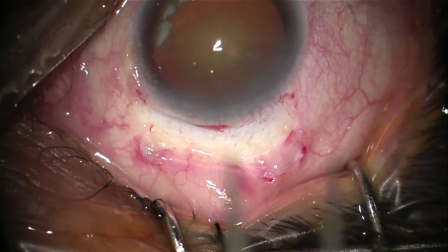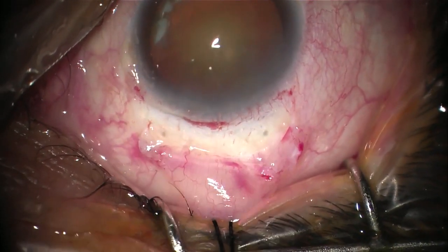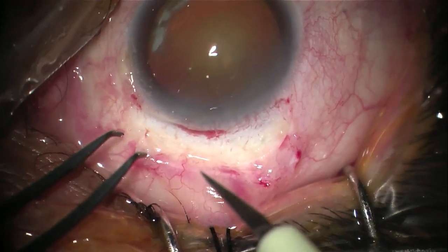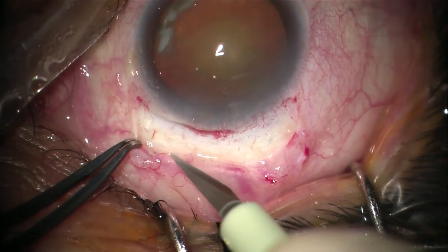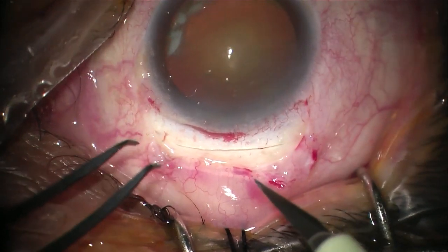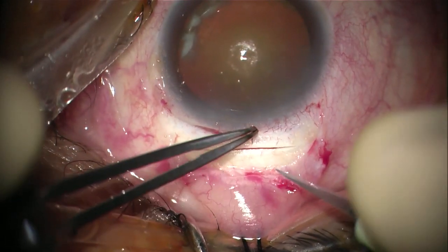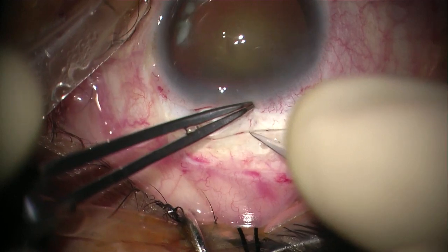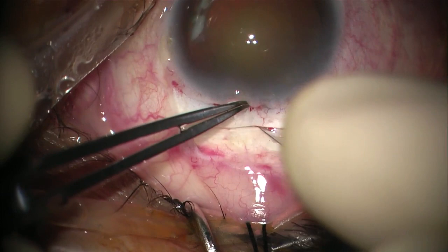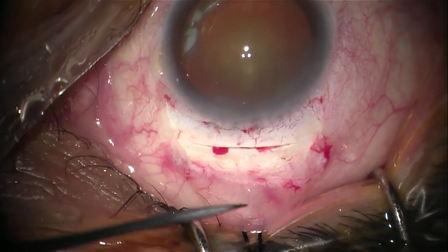Now we start creating our scleral tunnel, which is the most important step of the surgery and defines how the rest of the surgery will go. We start with a straight 6.5mm incision, 2mm behind the limbus. At the beginning it is difficult to get the precise depth on the first attempt, so my advice is to start with a superficial scratch, then check the depth and re-deepen the incision until you get your desired level. This is better than doing a very deep incision that could cause tissue prolapse at an early stage of the surgery.